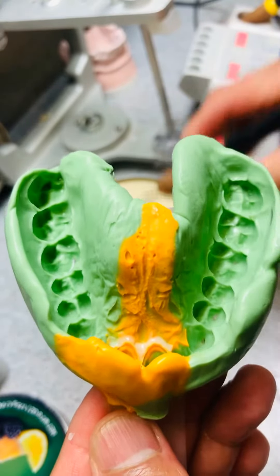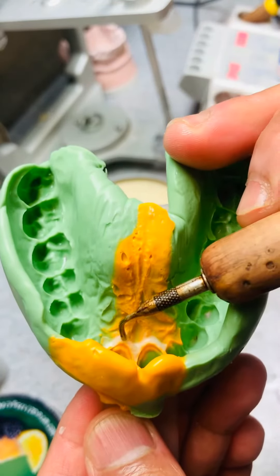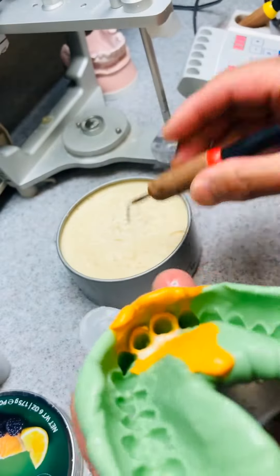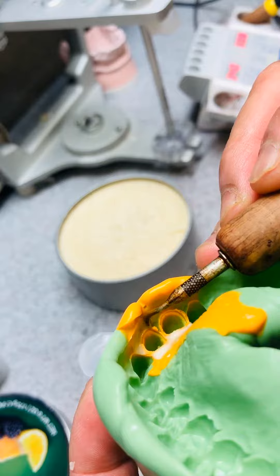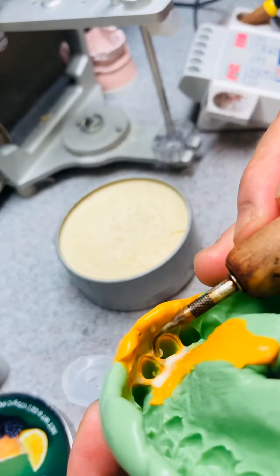If I want to preserve the margin areas, when the impression is set and the stone is set, you will see that the margin is very, very noticeable. I already have a little bit of a semi die-trimming started, so I put the wax on both areas.